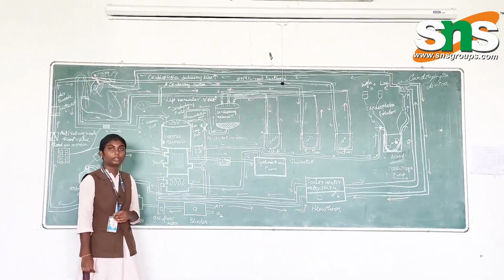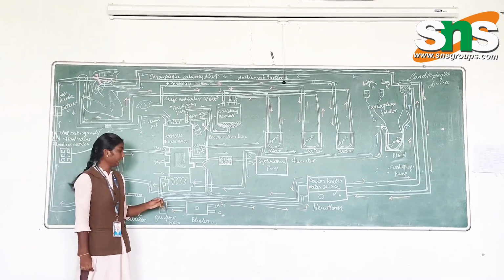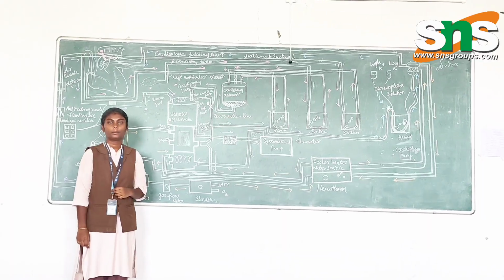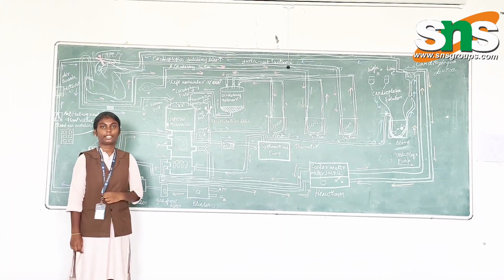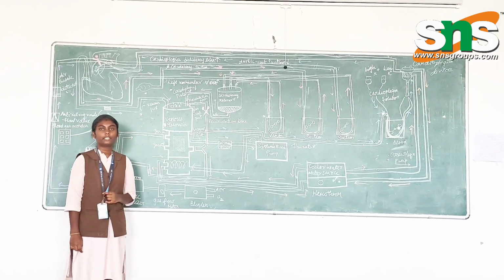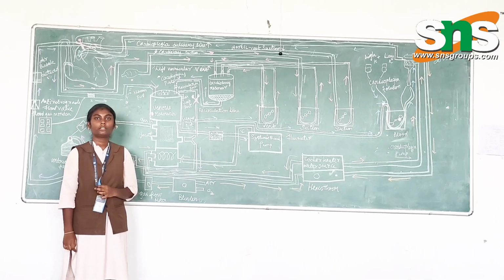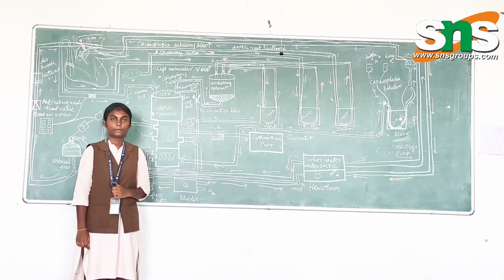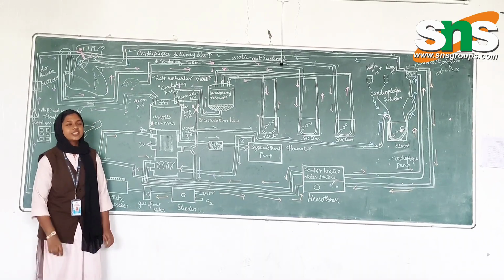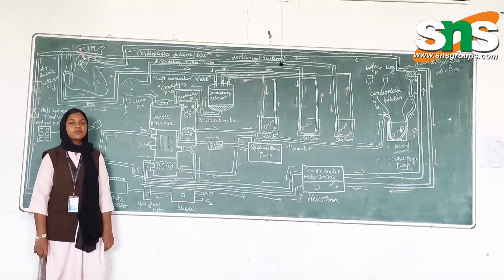Hemotherm's lines are connected to 3 parts: one is the cardioplegia device, the heat exchanger and the patient's bed. The heat exchanger works under the principle of countercurrent mechanism. There are 3 types of transmission of heat: conduction, radiation and convection. To increase 1 degree of heat in the blood, we should wait for 3 minutes, and to decrease we should wait for 1 minute. The oxygenator is used to transfer oxygen and carbon dioxide with the help of a blender.